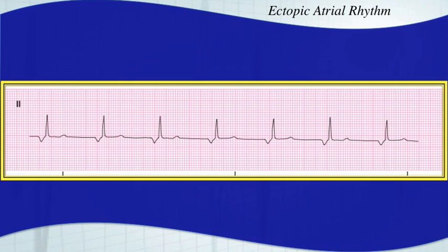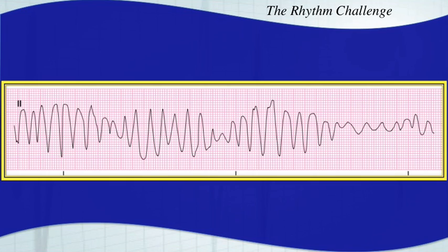The answer for this one is polymorphic VTAC. If you said torsades de pointes, I wouldn't count you off any points for that either. It does look like it has a bow tie effect. In fact, this looks a lot like early V-fib might look. A lot of people confuse early ventricular fibrillation for torsades.